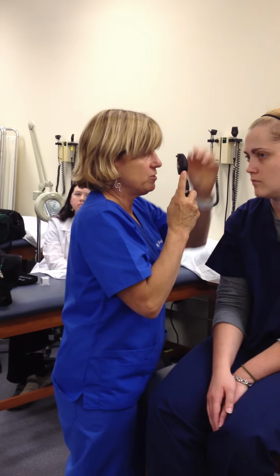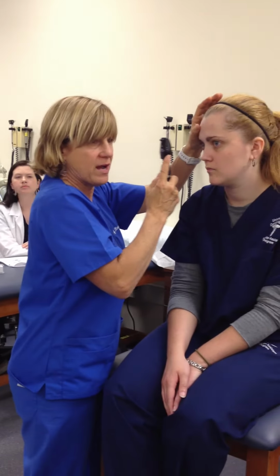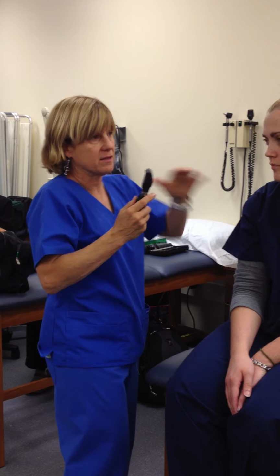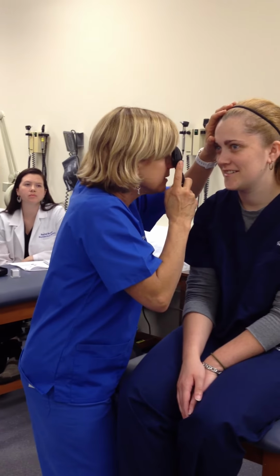When you get that light reflex, you just drive in a little bit. You really don't have to start way out here. Part of us, we start way out here and we're trying to get in the back of that eye, and it's like we're taking a long distance highway there. So start close and come in.